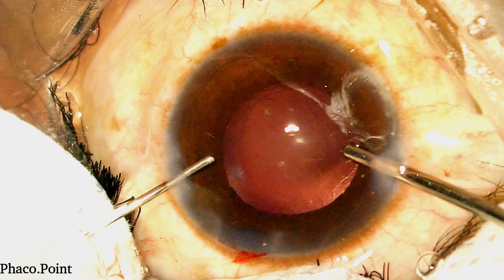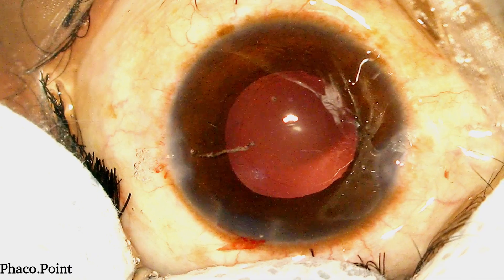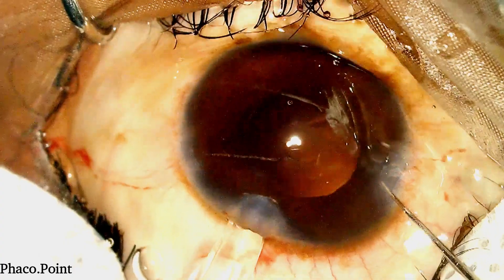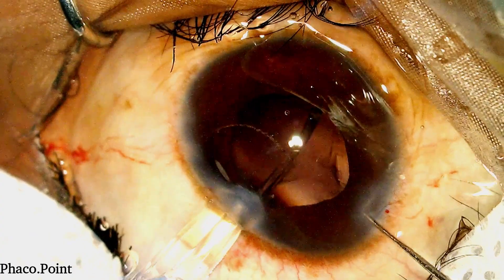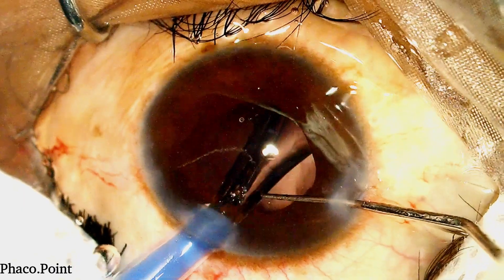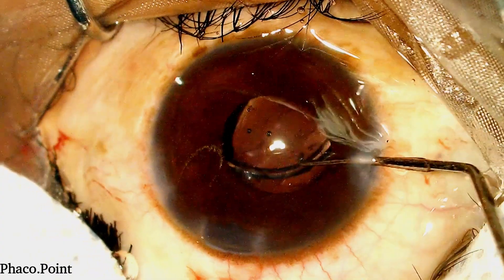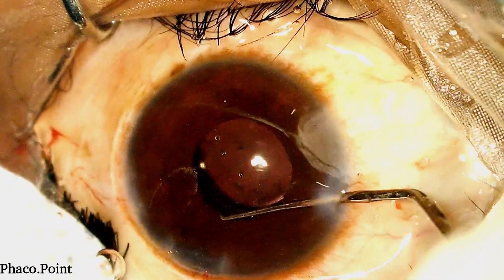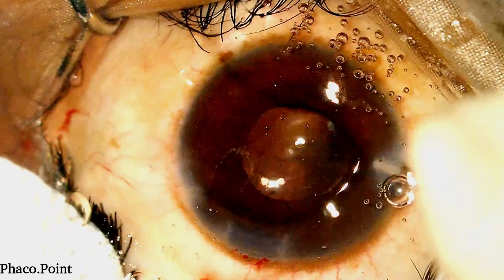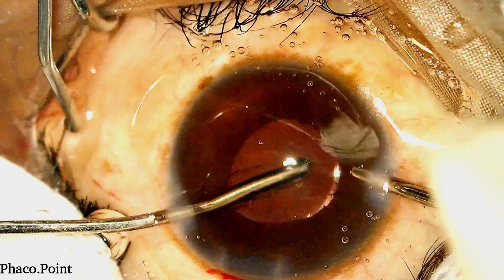Please note that despite the presence of some cells stuck to the posterior capsule, I have avoided the step of PC polish. It should be avoided in cases of a posterior polar cataract as it could result in a disruption of the posterior capsule. Under viscoelastic cover, I now introduce the single-piece monofocal IOL with care and caution gently into the capsular bag. Any manipulations of the IOL within the capsular bag should always happen under viscoelastic cover, because in a patient undergoing topical phacoemulsification, there is always the tendency of an upthrust of the posterior capsule.